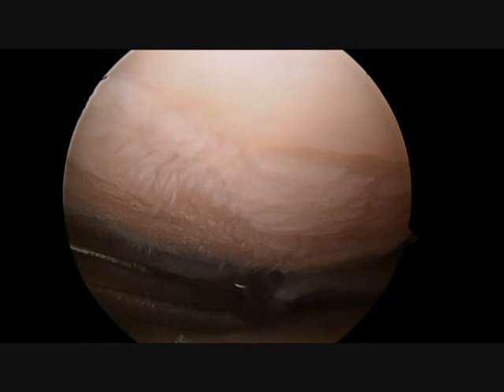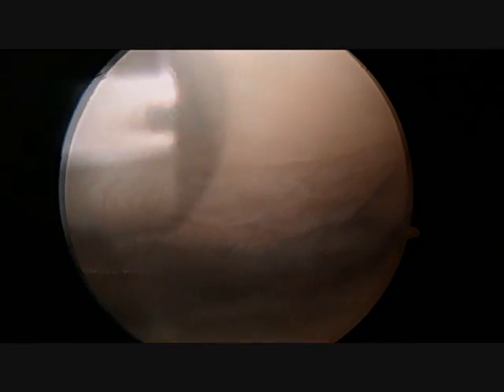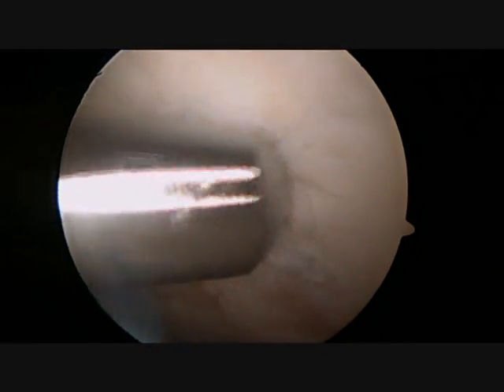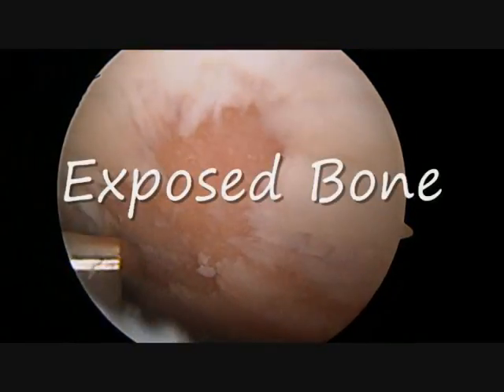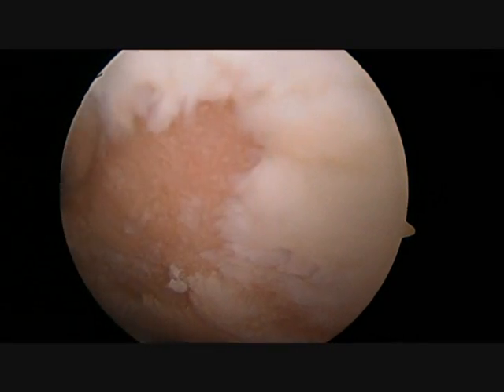I'm going to use the shaver to clean up the country road, but that will not change the fact that it is still a rough road. The meniscal cutter is then used to remove the torn edges of the degenerative meniscal tear and a suction shaver is used on the loose particles. The shaver is then used to smooth out the rough edges and remove the loose debris found on the cartilage of the femoral condyle.